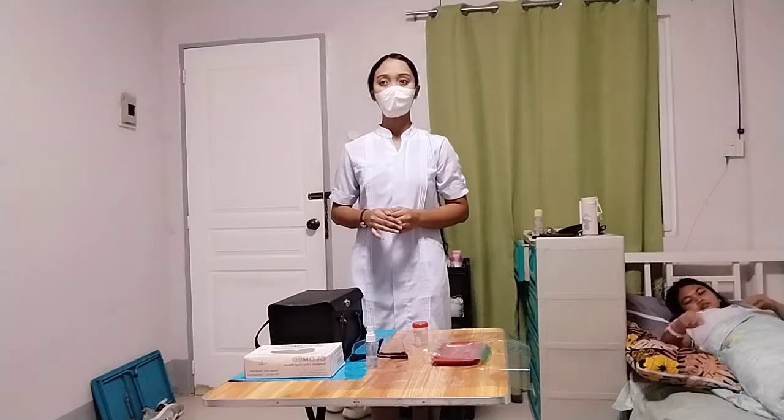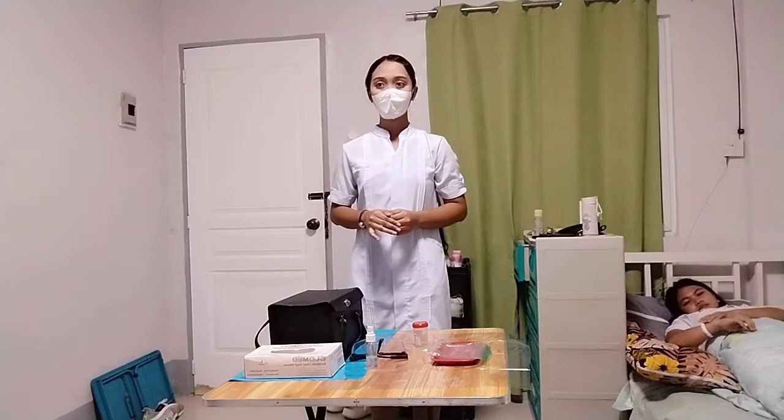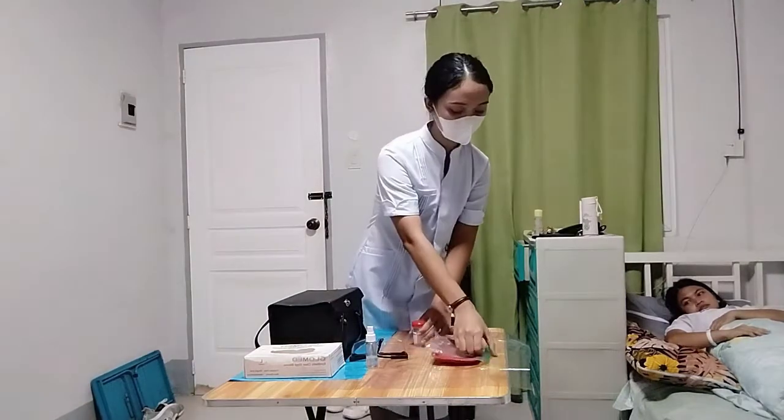Next, place labels on the container per facility policy. Place the container in a plastic, sealable biohazard bag and/or transport container. Remove the other PPE if used and perform hand hygiene.